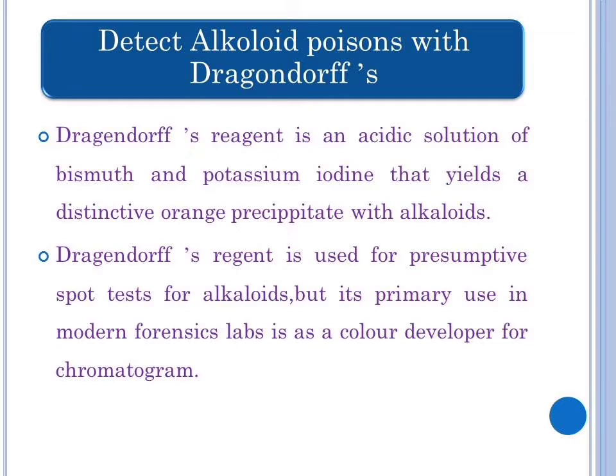In forensic toxicology, analysis was done strictly by wet chemistry techniques because many different plant alkaloids, such as nicotine, strychnine, aconitine, and quinine, are fatal in small doses.